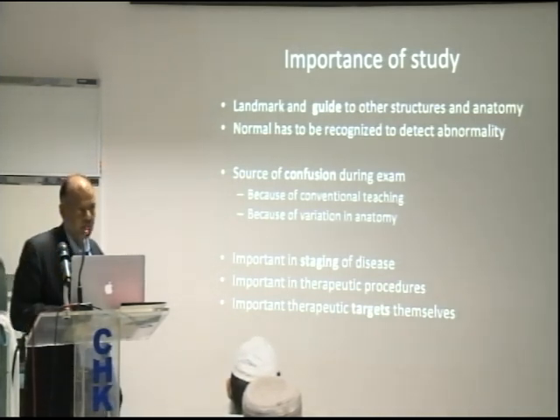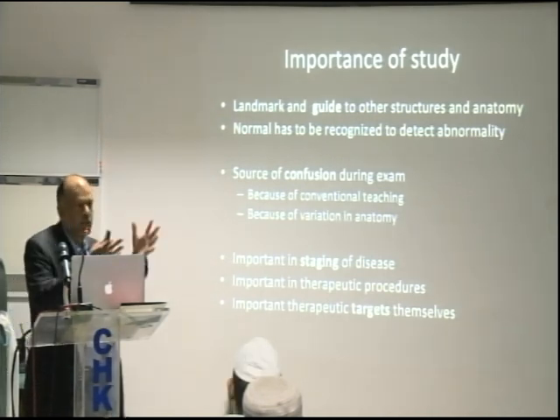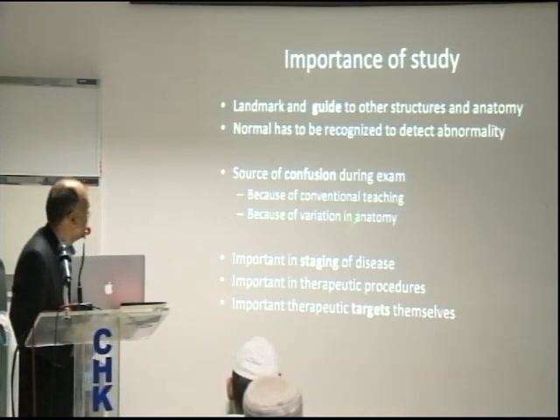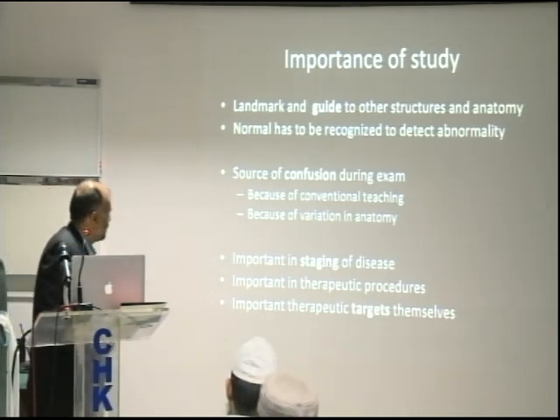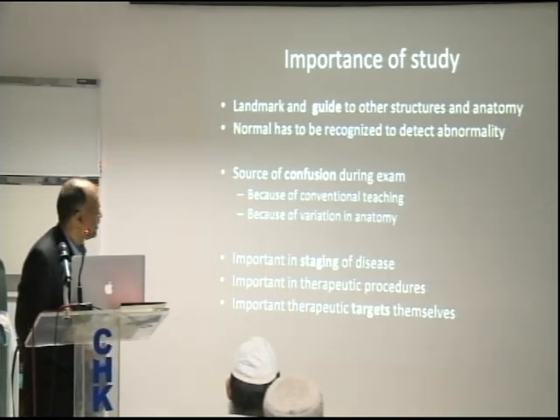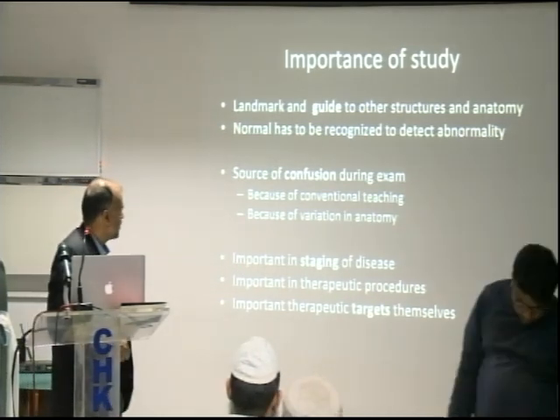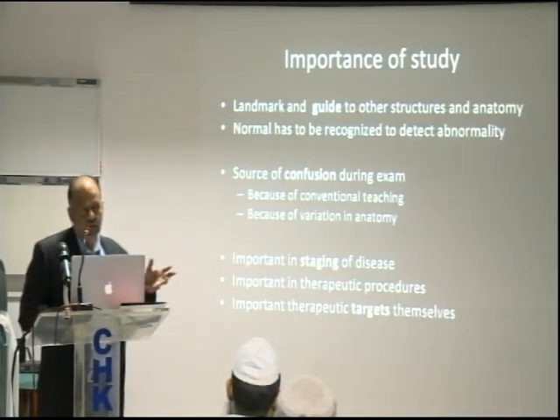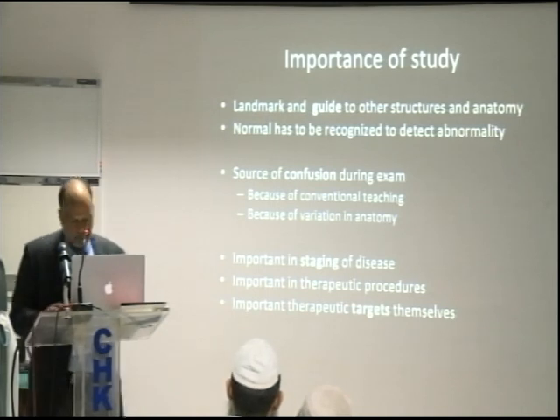While you're doing it you would say, what is this? Where am I? So it disorients you. And of course there is variation in anatomy. Vessels are also important in staging of disease, and in the future they're going to become therapeutic targets, so you'll have to identify the vessel you're working on.